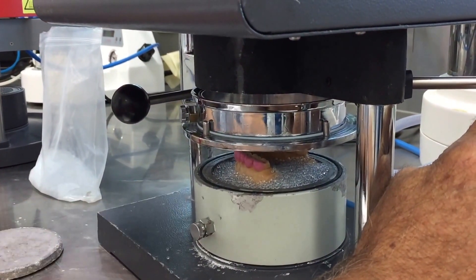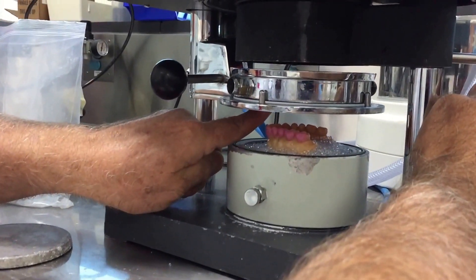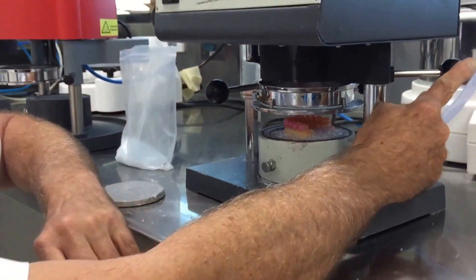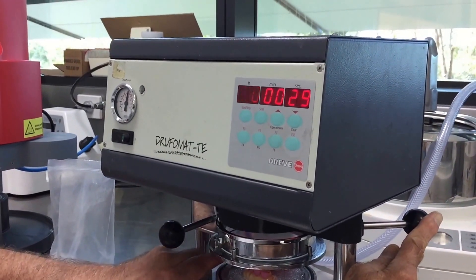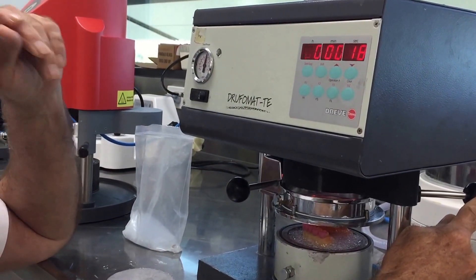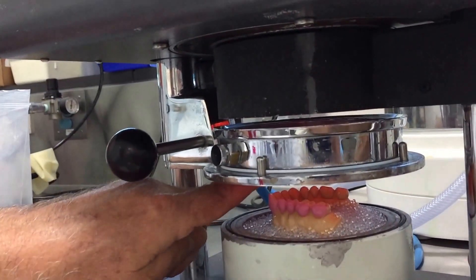When the blank reaches the right consistency — if you have a manual machine and want to test whether it's ready — what you're feeling for is when the blank starts to sag, and you can feel at the outside rim that the blank becomes a little bit sticky. That's a fair indication the blank will adapt with some accuracy around the interproximal areas. The general rule for cooling is that once you've adapted it, you cool it for the same length of time as you heated it — so one minute and five seconds. You can see how the blank is getting quite floppy.